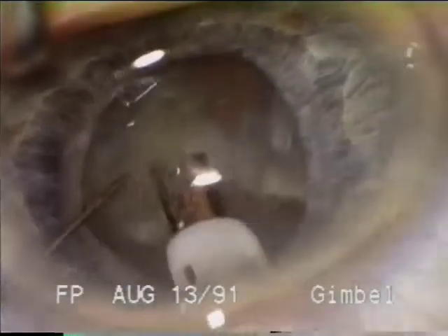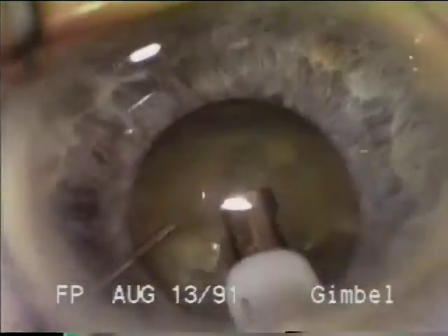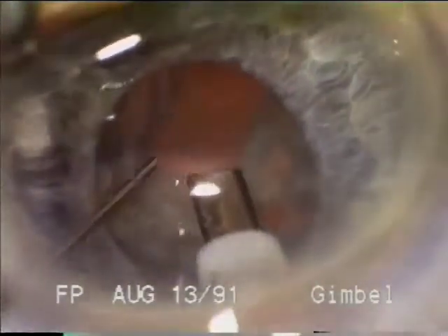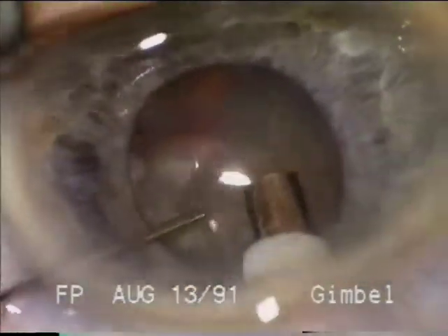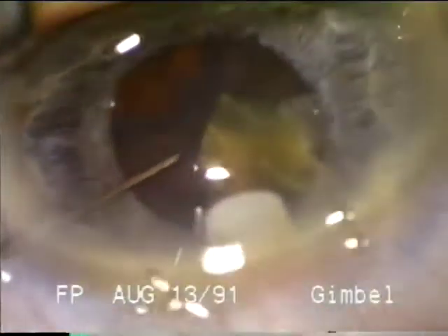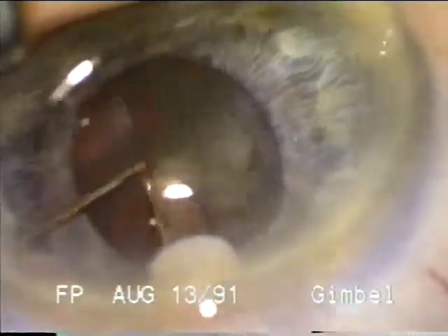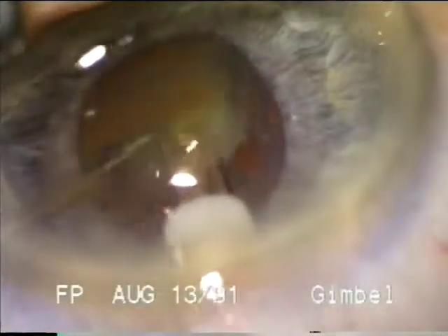Once the fracturing is complete, the fragments are brought — sometimes being divided further — using the two instruments as the section comes to the center of the pupil. When just one or two fragments remain, the posterior capsule can come up to the port, so one must be more careful using lower power and lower flow rates. As the last section is emulsified, the cyclodialysis tip should be kept under the phaco tip to prevent the capsule from coming to the port unexpectedly.